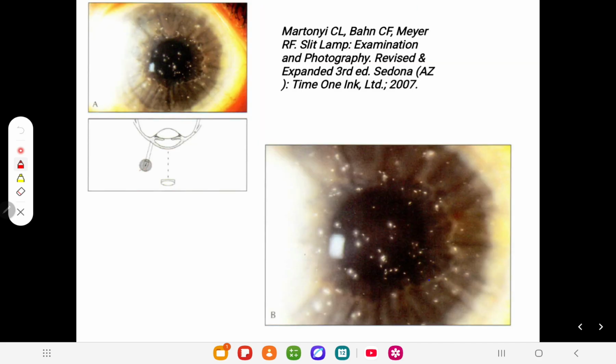Okay, so in this particular picture, sclerotic scatter, can you see these things, this edematous, this small thing, and whenever it zooms, can you see the edematous points that clearly? It's very important, this sclerotic scatter.